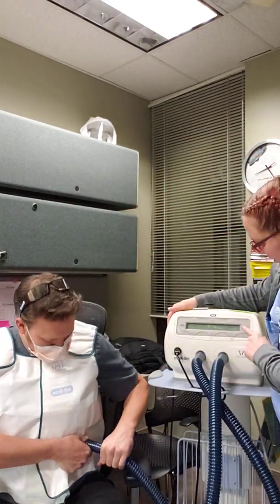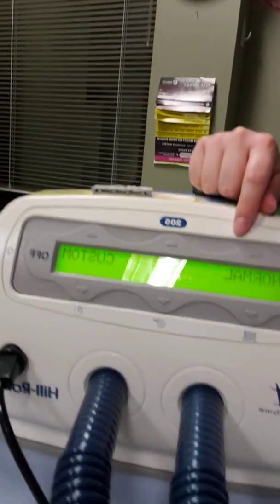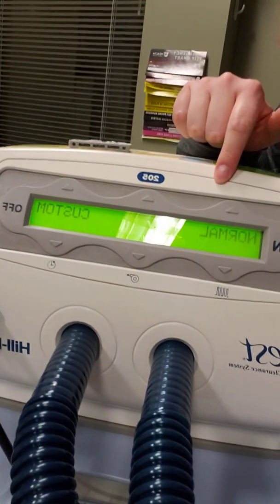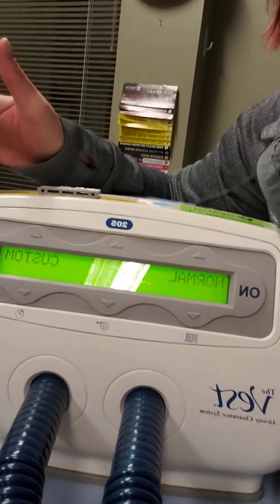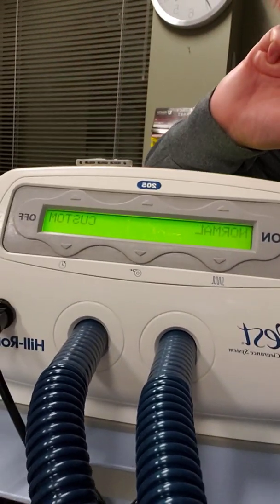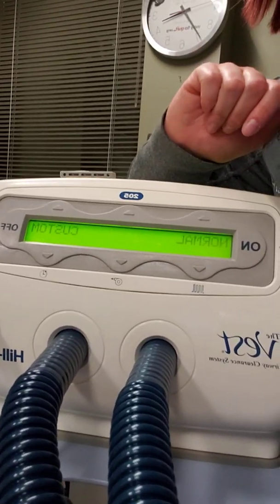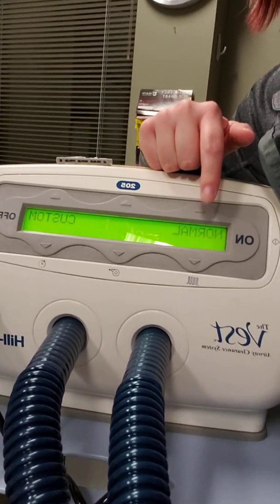You want to make sure they are snug because it is going to take a little bit of work. To turn the machine on, you plug it in and press on. It will come up with normal and custom. The normal setting runs for 20 minutes. The custom setting also starts for 20 minutes, but depending on the cystic fibrosis clinic or the hospital's protocols, it will have breaks for a patient to do huff cough, which we will talk about in a different video. So for this situation, we're going to do normal.